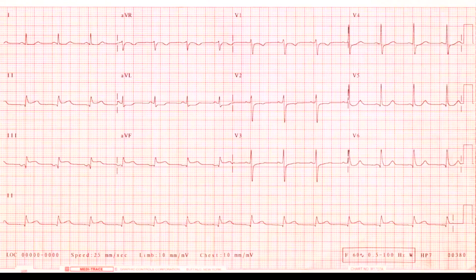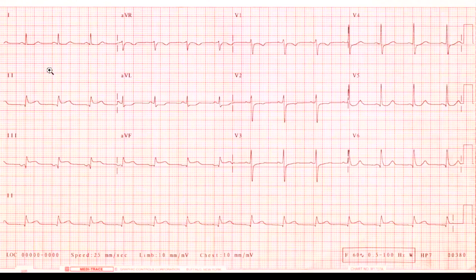This is an electrocardiogram. It's very cheap, very quick, and easy to obtain on most patients. As you can see here, we have a number of leads that are looking at the heart in different ways at different angles, and we get different types of information from the heart as we look at it from different angles.